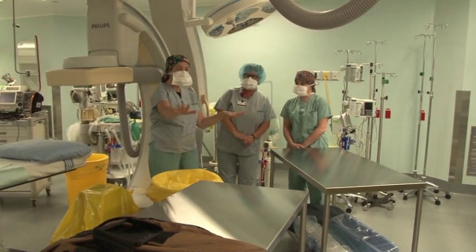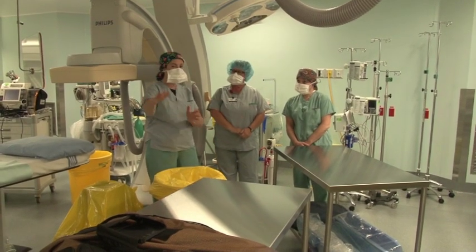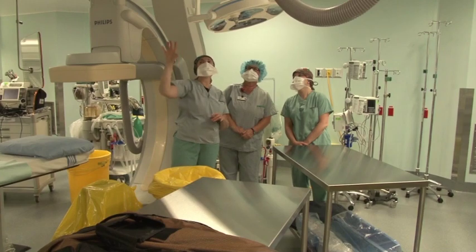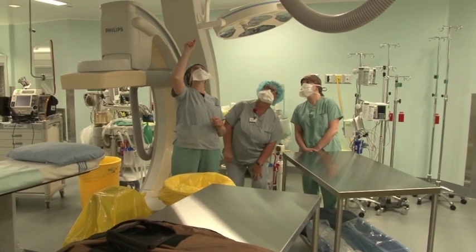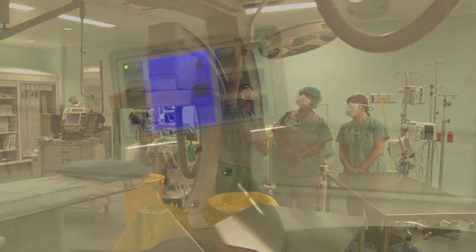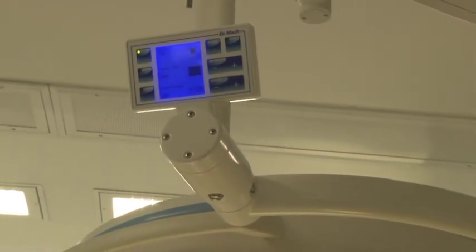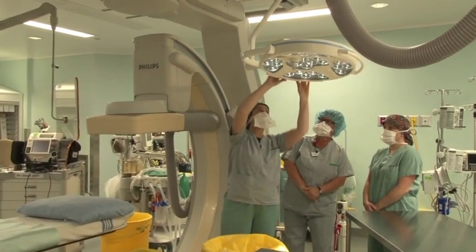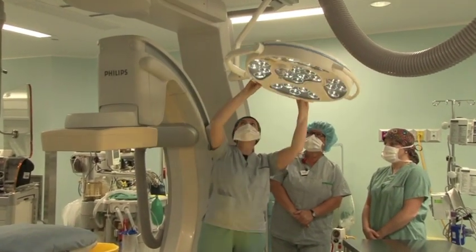Okay, so Brandy and Sue, when you're standing at this angle, when the patient is on the table, we use these two tables for our sterile setup for our trays and our supplies. This is the light that Dr. Toll will be using so he can see well his incision and when he's looking for his cephalic or subclavian. And there's an on and off switch right here on the side. And Dr. Toll may ask us from time to time to angle it, and it's just very easy. There's just handles here on the side.